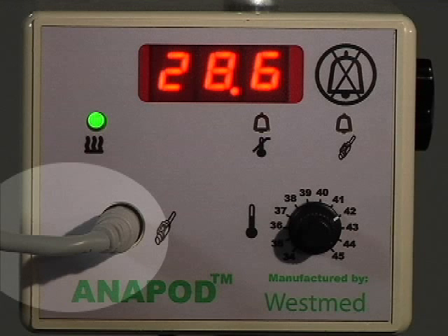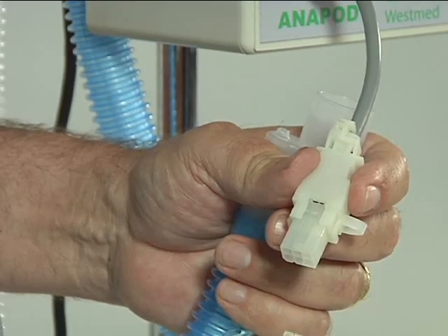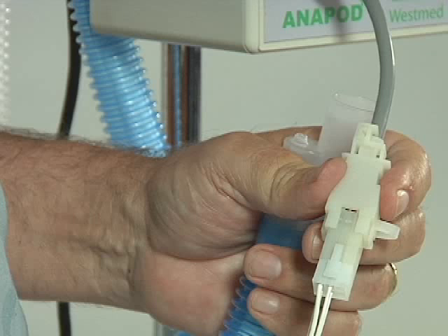Connect the Anapod cable assembly to the front of the controller. The opposite end of the cable assembly has a white six-pin plastic connector that connects to the six-pin plastic connector on the heated wick circuit. These two connectors lock together with a snap when properly connected and are keyed to prevent improper connection.